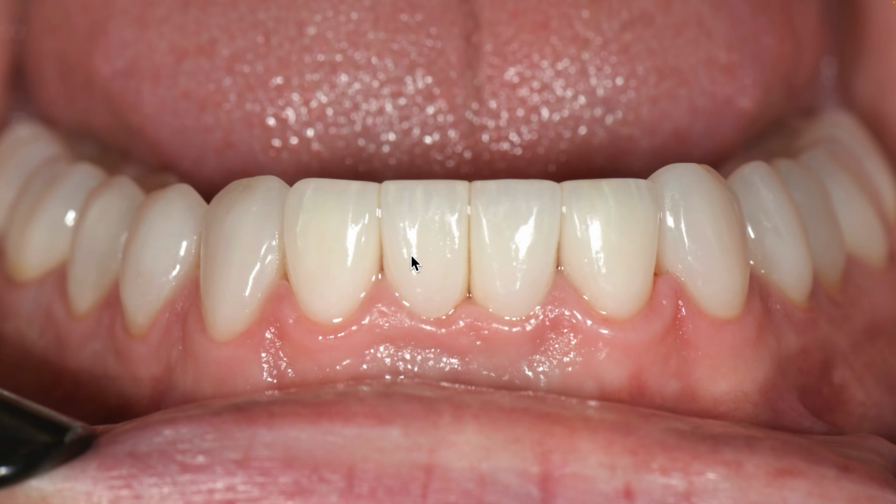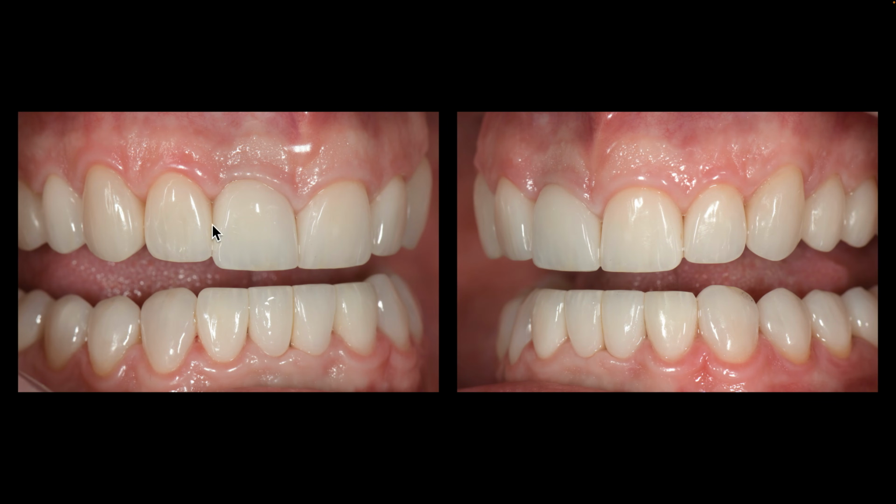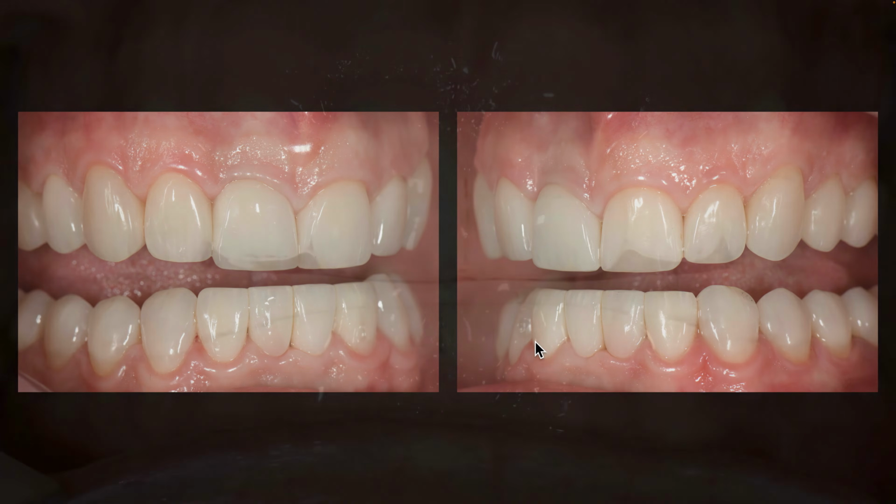And then the lower, I was really pleased with the way this turned out because I was concerned we weren't going to be able to make these look good or even fit good. And it looks like the fit is really good. The tissue is nice and healthy. And aesthetically, it looks like a pretty darn good match. And then some side views. Looks pretty darn good.